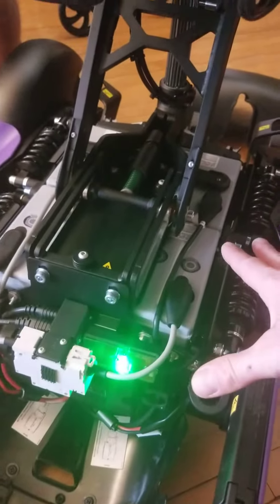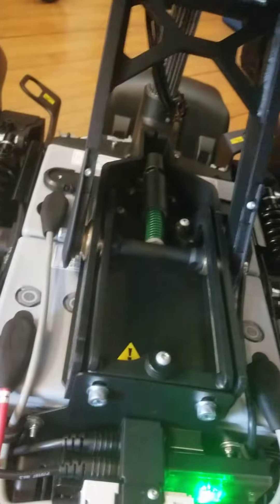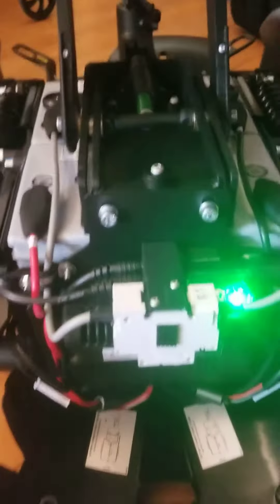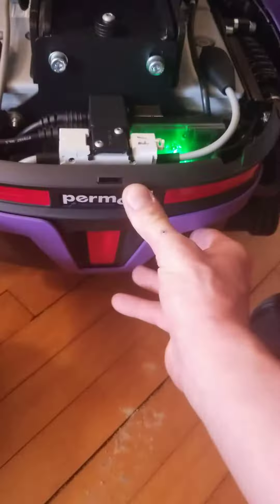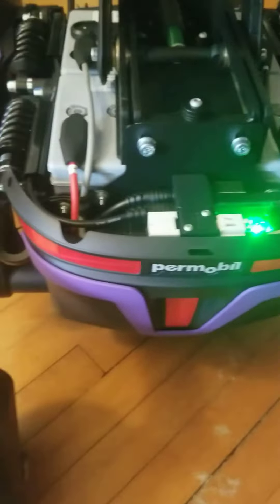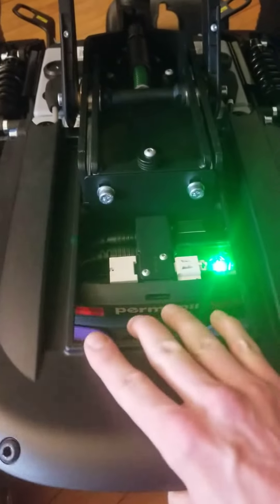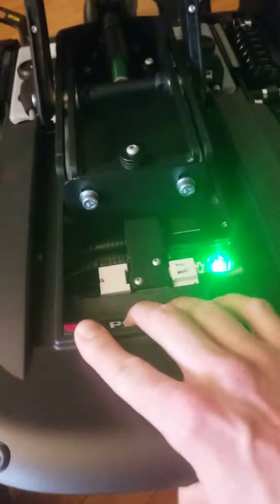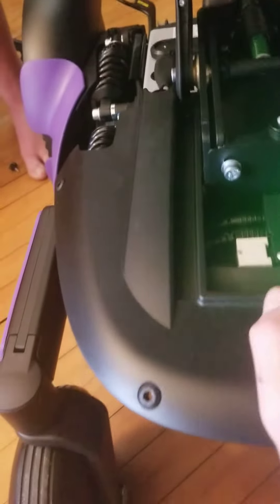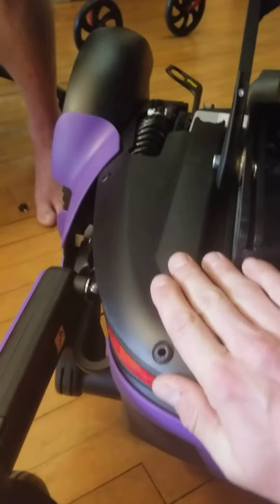Once those batteries are out, you're free to drill the holes in the bottom, under the batteries. These are usually a pretty tight fit just to allow for a low seat height when needed.